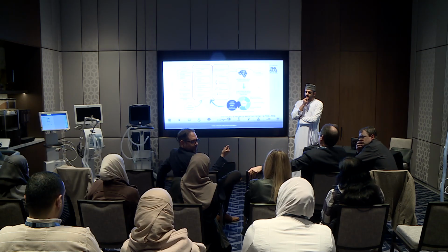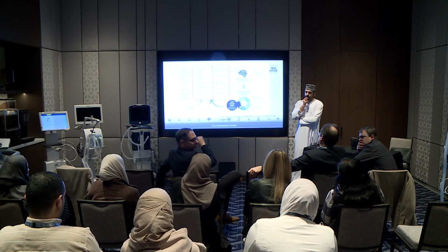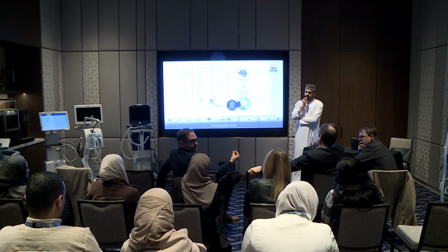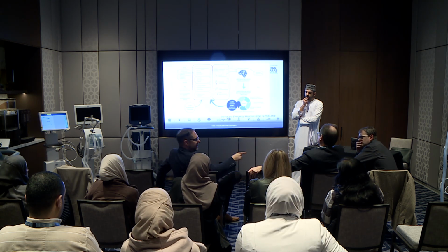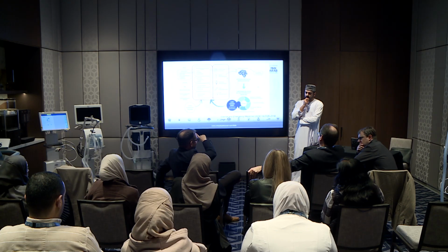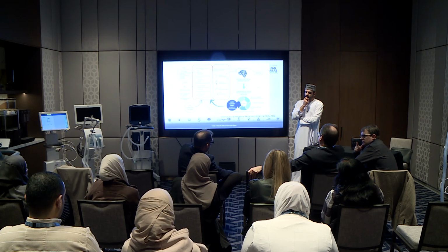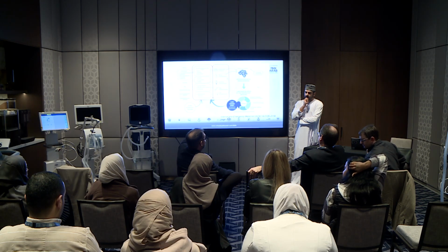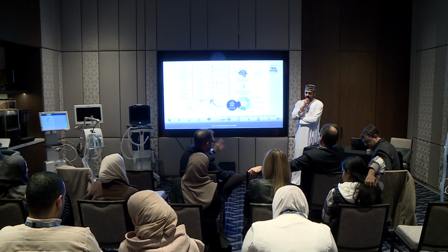The key is to catch them off guard and to get the first breath you get, because it will reflect what was going on prior to that. Anything beyond that, they start to recognize that you're occluding the airway. And you'll likely see a change in EDI, but the nice thing, if you look at that graphic, even though the drop in esophageal pressure is larger, that has to do with isometric stuff. It's not an increased contraction, the EDI is stable through that single breath.